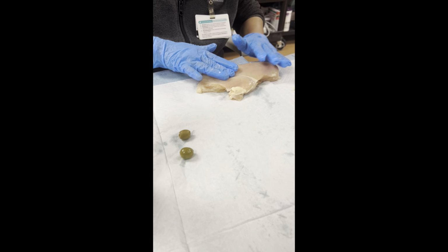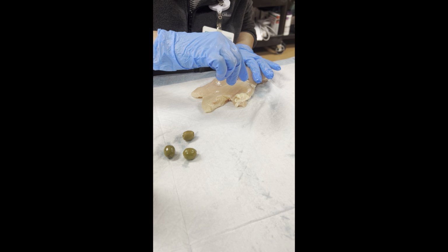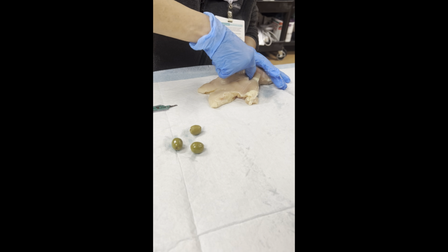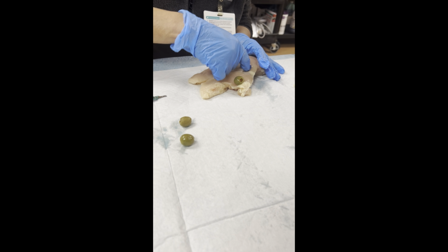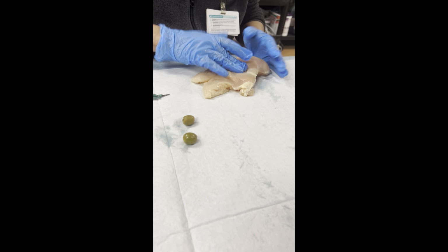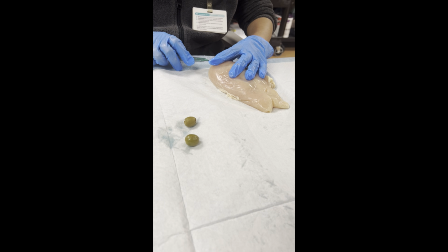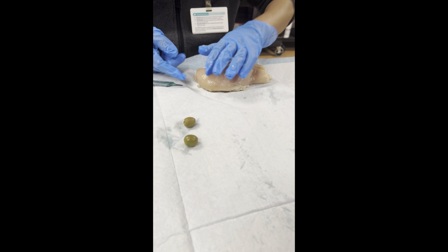They go through many different simulations, of course, but this one in particular was just a setup for practicing biopsy of a mass in breast tissue. To do this, we take some boneless, skinless chicken breasts and make a small incision in the breast to create a small cavity to place a green olive inside. Each breast gets about 2 to 3 olives placed inside.